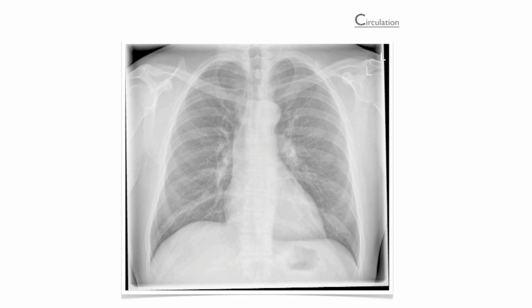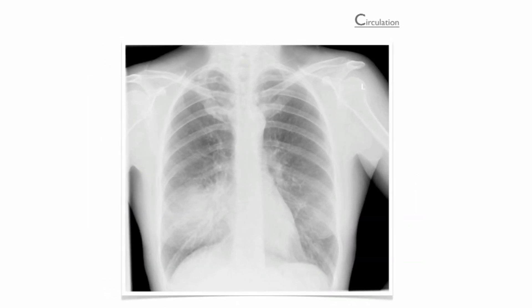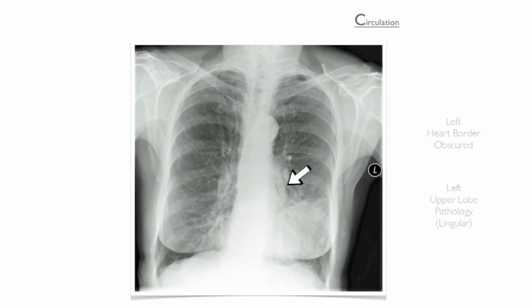In this section of our mnemonic, we review the heart silhouette. Trace the silhouette, paying particular attention to the aortic knuckle and the left and right heart borders. Look for swelling of these borders, which is suggestive of an aortic or ventricular aneurysm. Note that loss of the heart border is suggestive of disease in the adjacent lung lobe. For example, in this image you can see loss of the right heart border caused by right middle lobe consolidation, and loss of the left heart border caused by pathology in the lingular region of the upper left lobe.